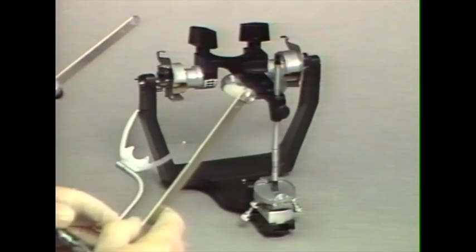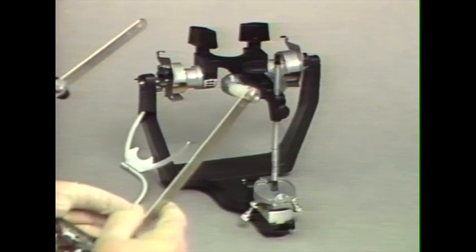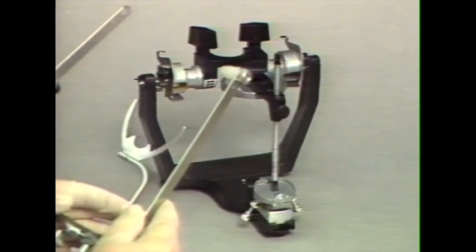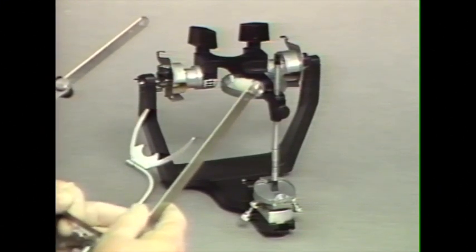The Facebow record can be transferred to the articulator by one of two methods. One is by the direct transfer, where the Facebow itself is used. The second is with the mounting platform, where an indirect mounting is used.